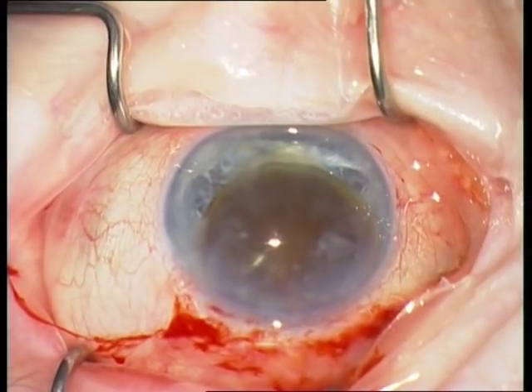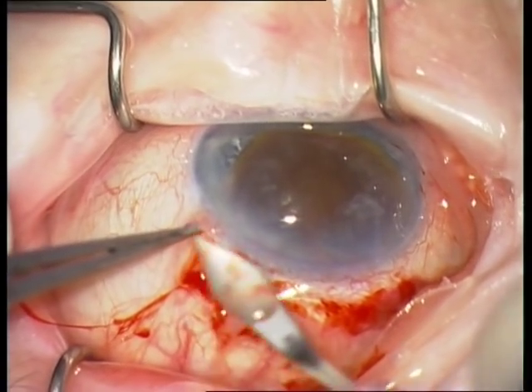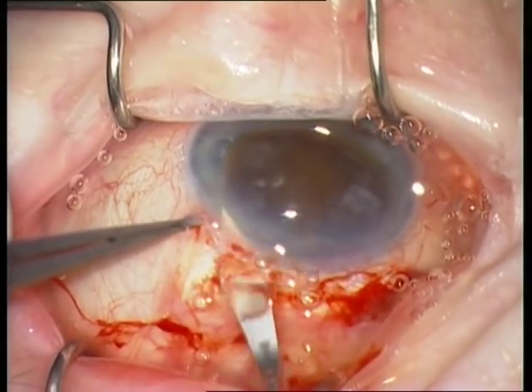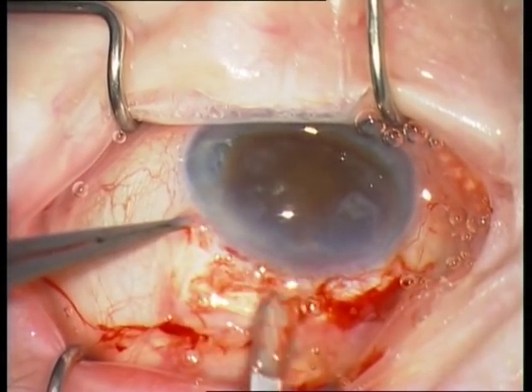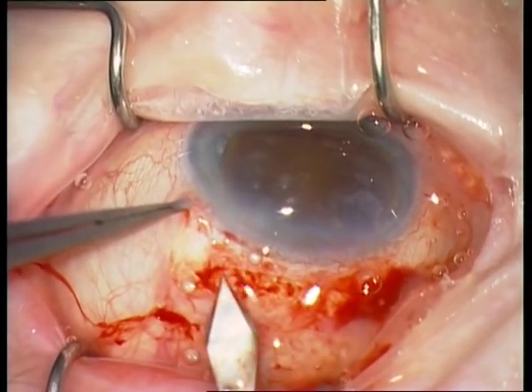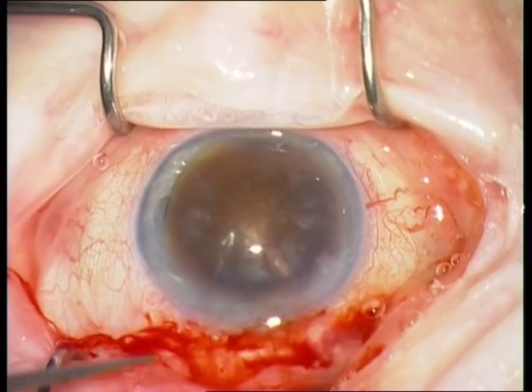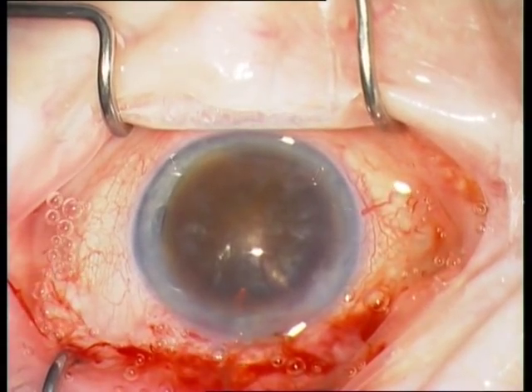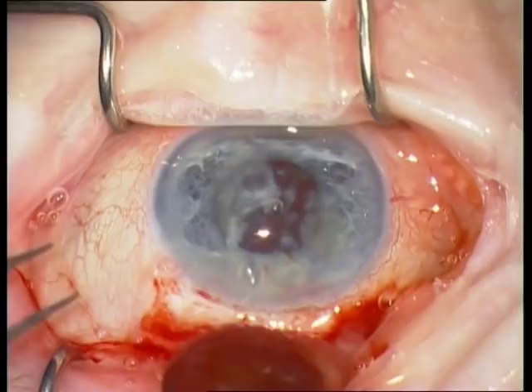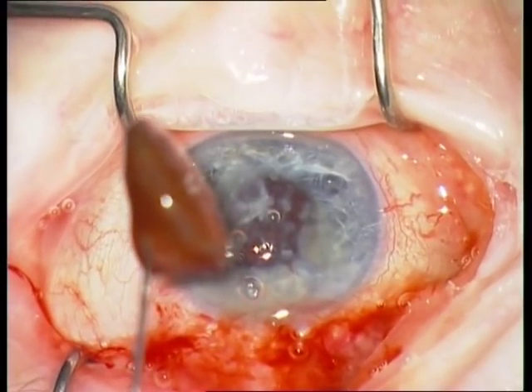Insert the fish hook and pull out the nucleus. If the nucleus gets stuck, don't continue — widen the frown incision with the 2.4 mm blade. Then start a new attempt: insert the fish hook and extract the nucleus with the fish hook. A very brown nucleus.